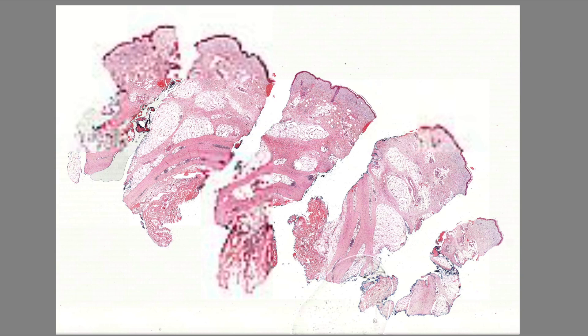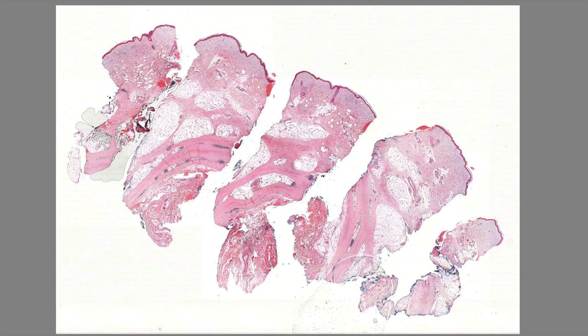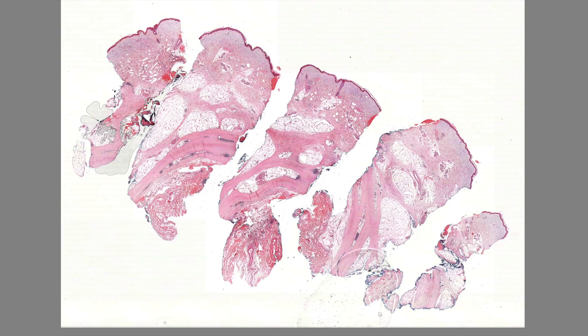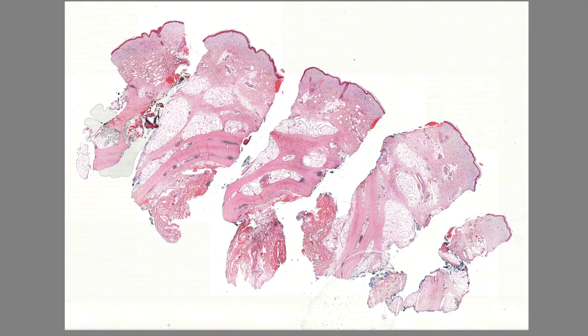In low power, you can see this really deep biopsy — you can see something really sticking down there.